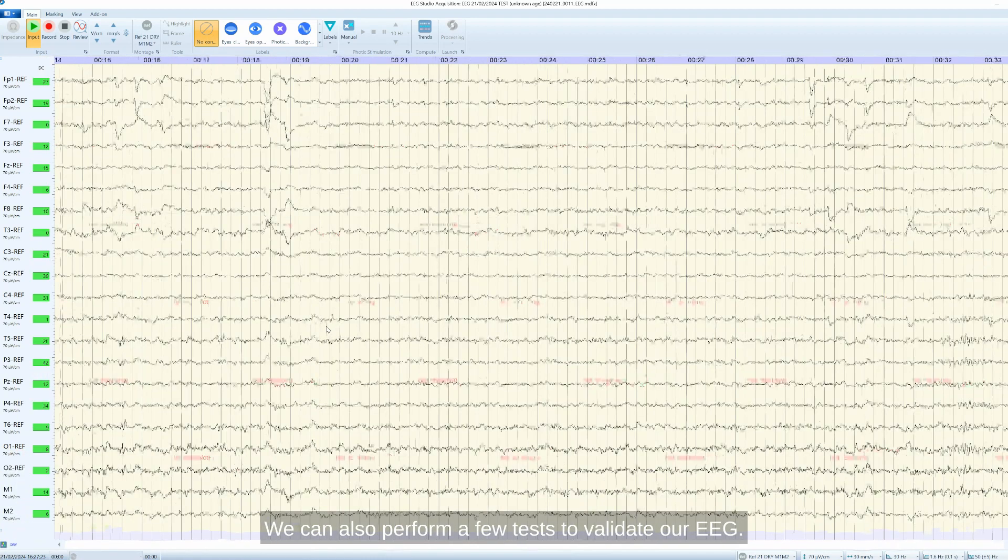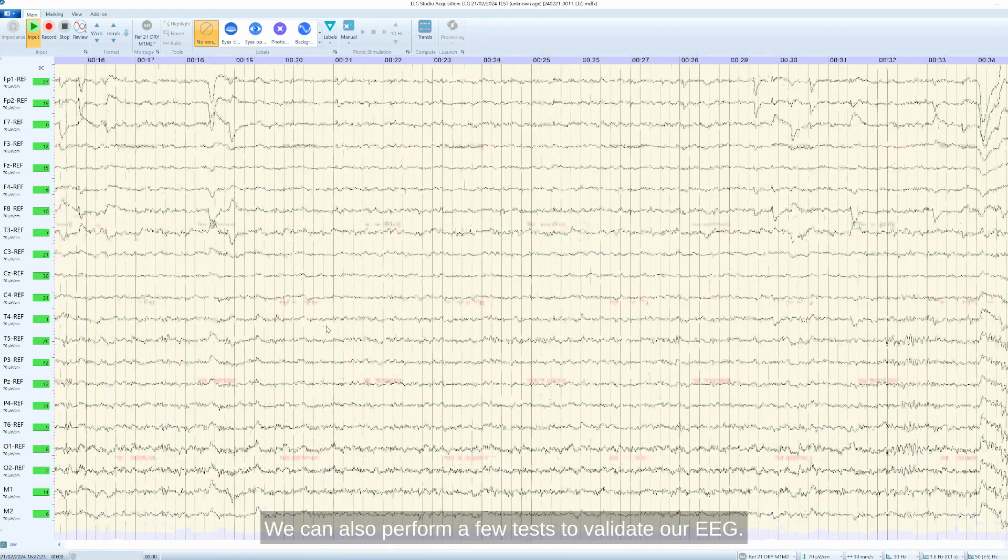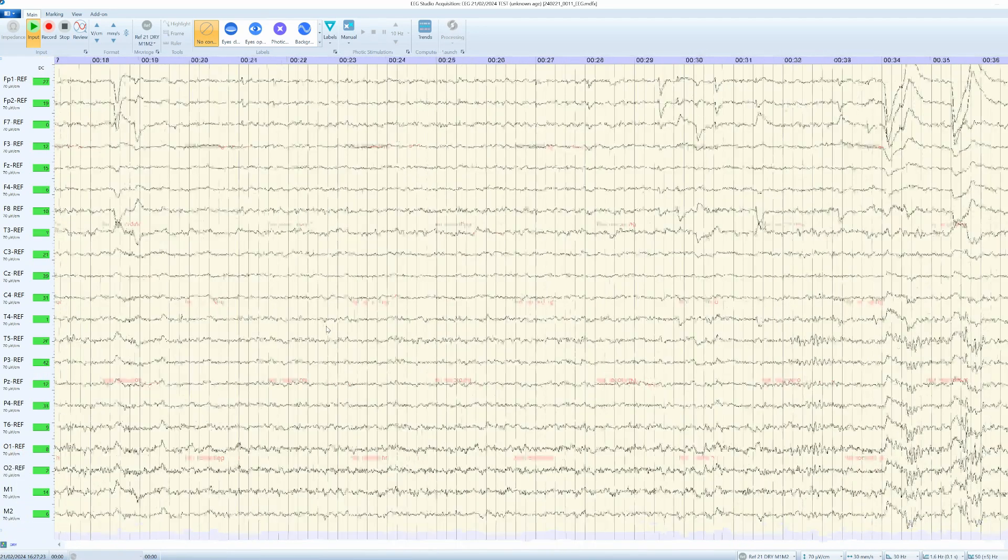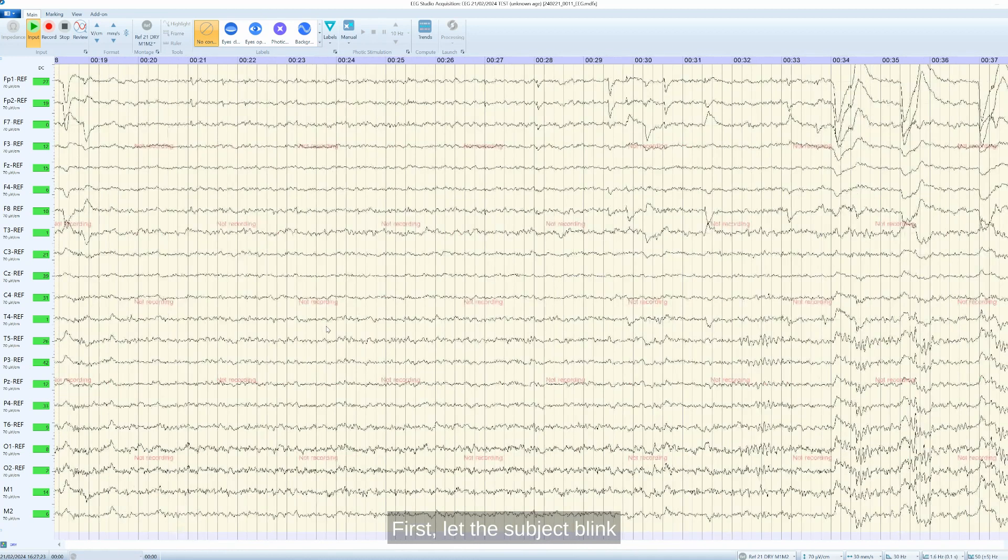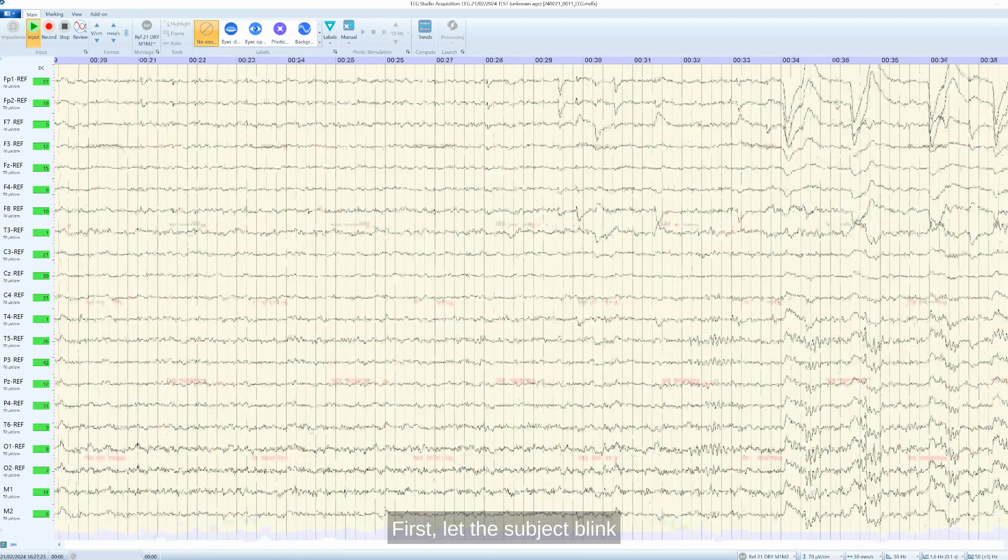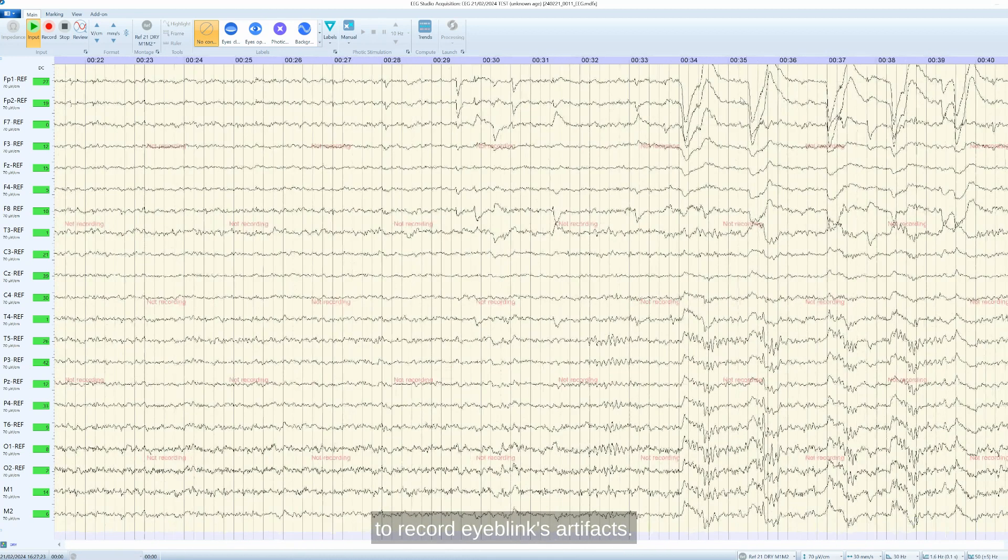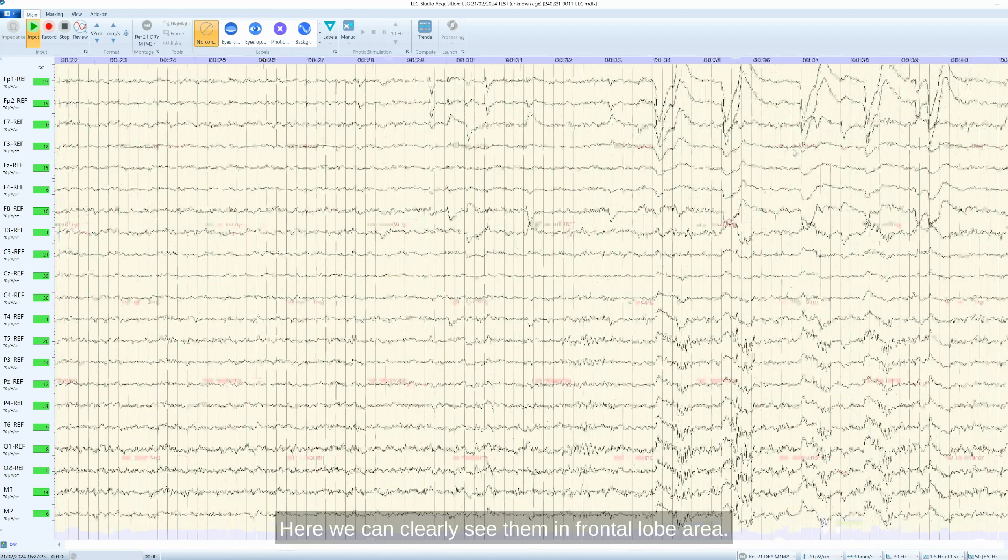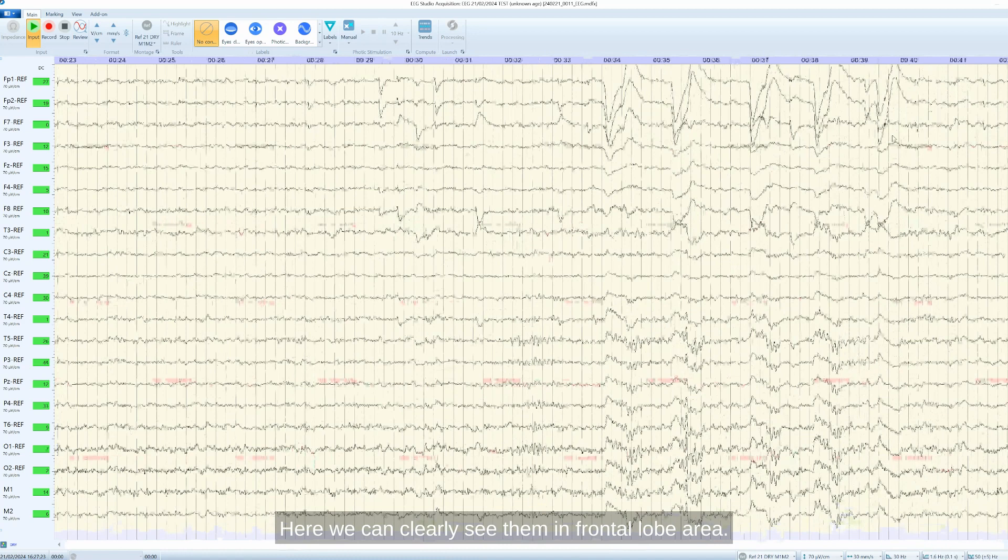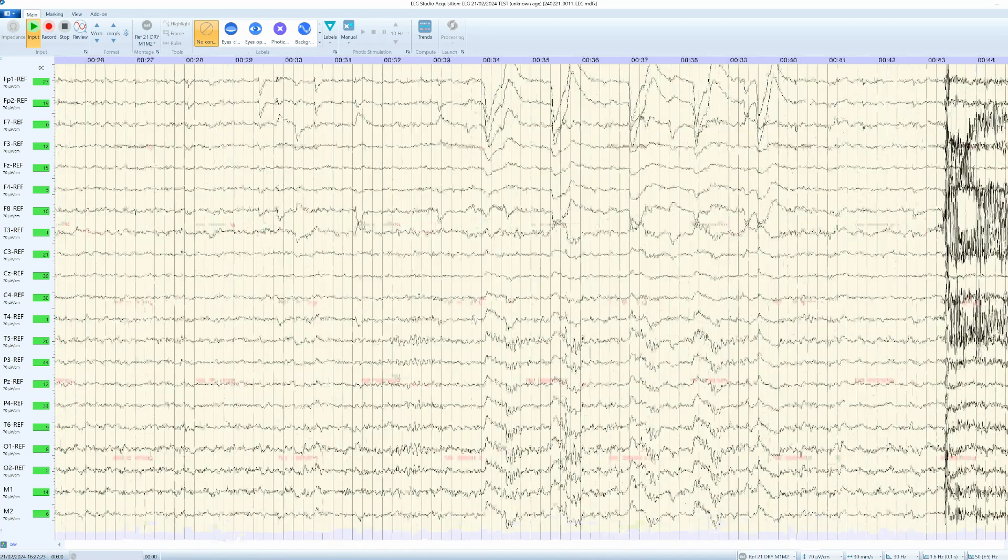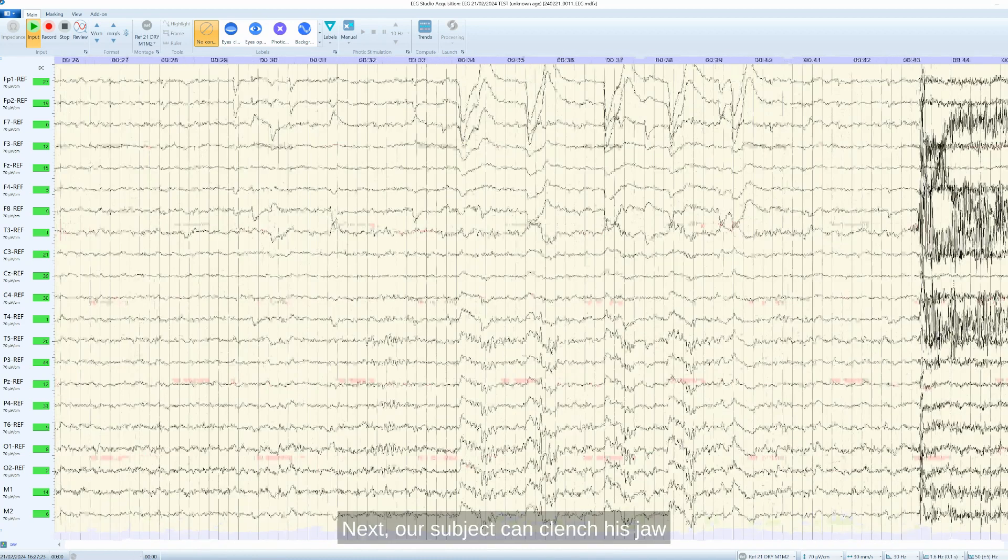First, let the subject blink to record eye blinks artifacts. Here we can clearly see them in frontal lobe area. Next, our subject can clench his jaw that we can clearly see EMG artifacts.